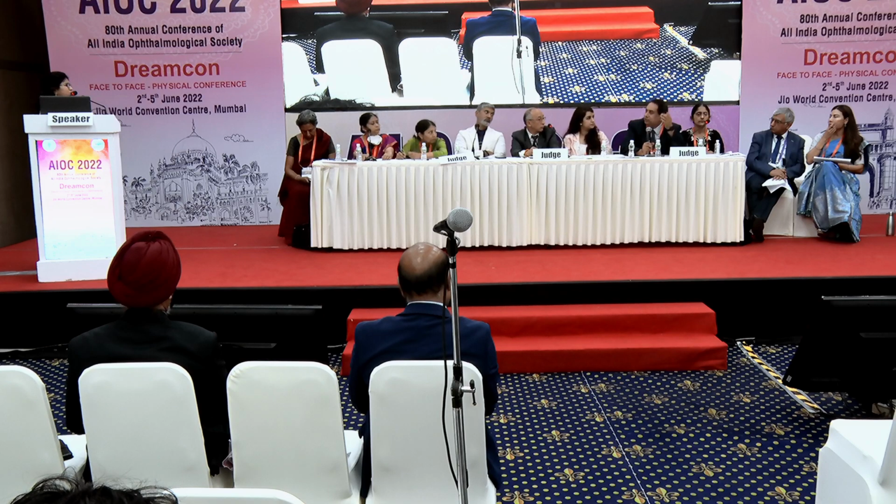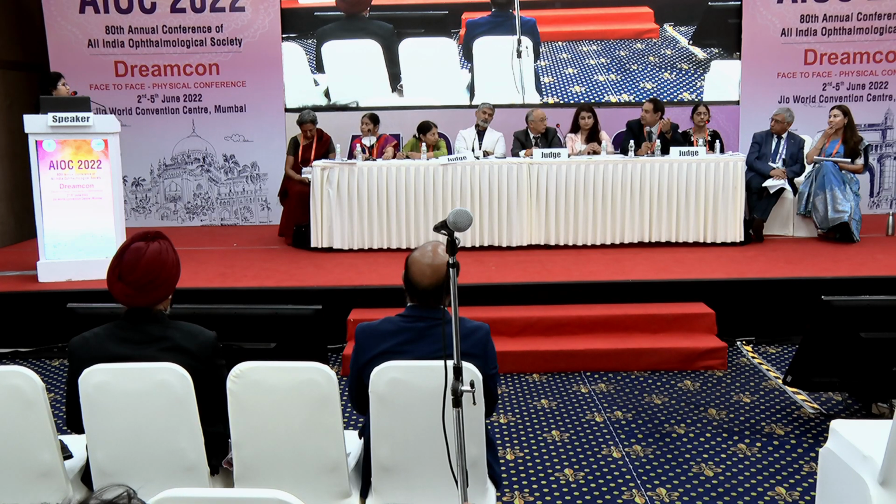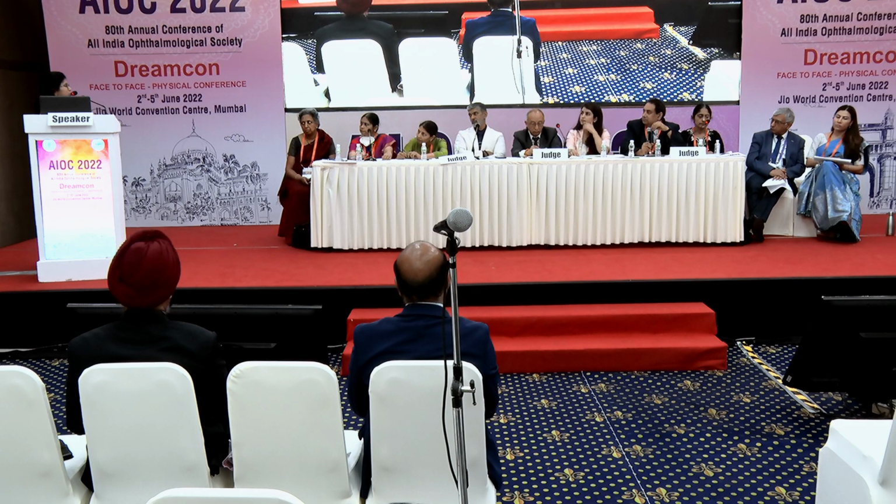You have so many concomitant abnormalities, diabetes, hypertension, all of them, even without having retinopathy, they cause changes in the vessel density. Yes, sir, that's a very valid point, but then most of the NAION patients do have this systemic association, so there is no way we can exclude it.